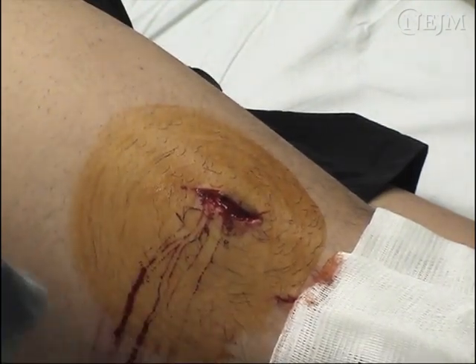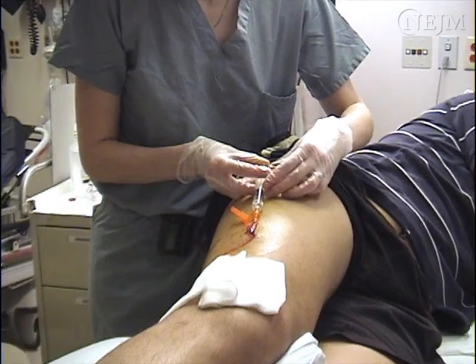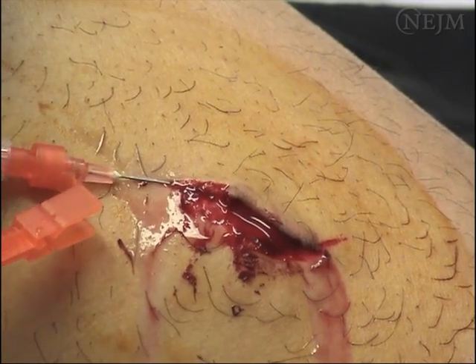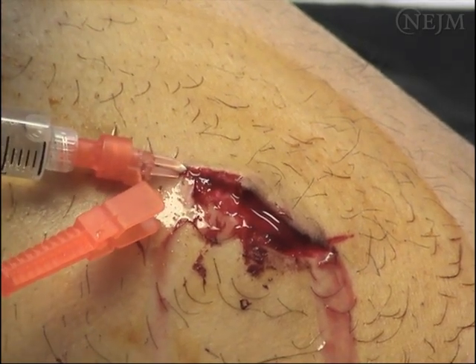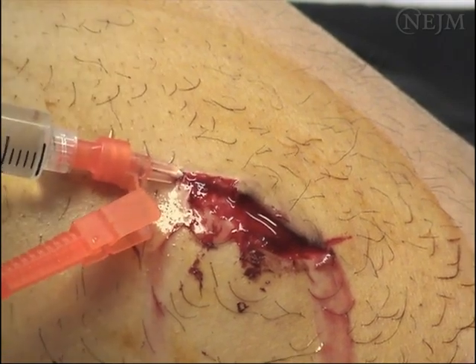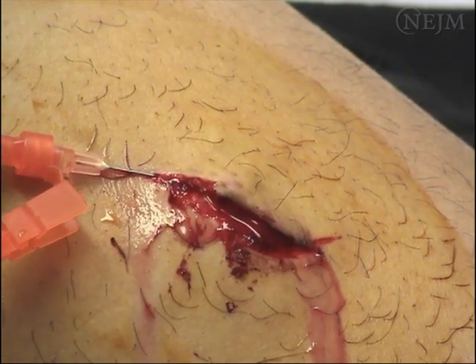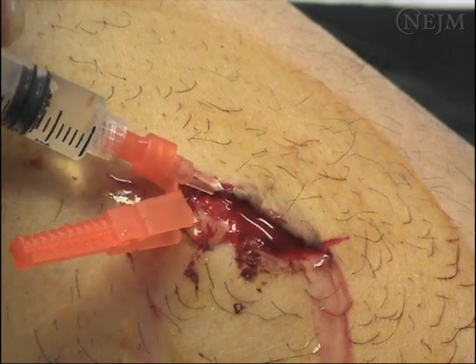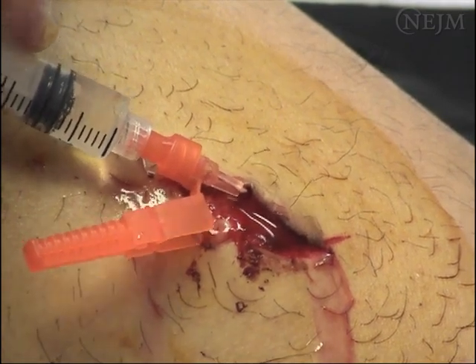Do not introduce antiseptic solution directly into the wound, since many are toxic to the subcutaneous tissues and could interfere with wound healing. Next, anesthetize the tissues using the preferred local anesthetic and a 25 to 30 gauge needle. Place the needle directly into the exposed subcutaneous tissue at one end of the laceration, pull back on the plunger to avoid intravascular placement of the agent, and then slowly inject anesthetic as you advance the needle. Inject the anesthetic in the plane between the dermis and the subcutaneous tissue because this location offers less resistance and is less painful than direct dermal infiltration.